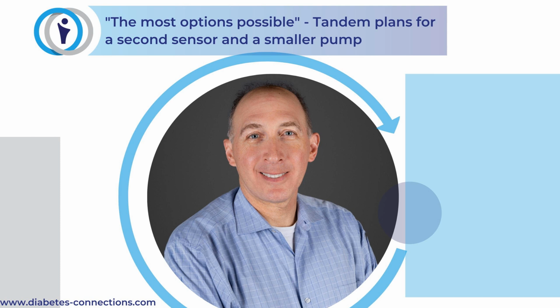Yeah, I do think there's some really interesting aspects to Sigi. So for those who are not aware, we acquired this company and the Sigi pump just very recently. And it's a pump that's still in development. So, I can't comment again on actual timing because it depends on many factors, like development, testing, regulatory submissions, different geographies, et cetera. I think what's really interesting about the Sigi pump is the potential, down the road, to use, for example, a pre-filled cartridge that could slide into that pump if it is compatible. That makes the pump easier to use, right?